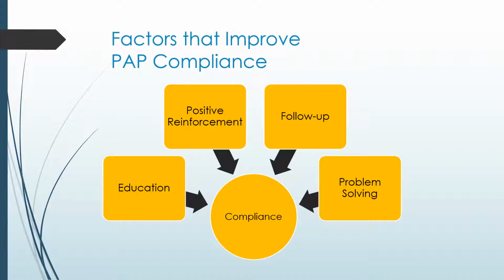Other factors that can improve compliance, of course, education is a huge role: how it's going to benefit the patient for their lifelong as well as the immediate future, what their role in their treatment process is, that they need to let you know when they're having problems so you can help them solve the problems, understanding life consequences if they choose not to wear their CPAP.